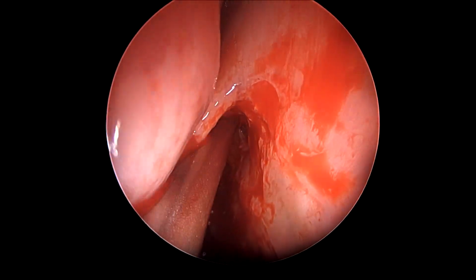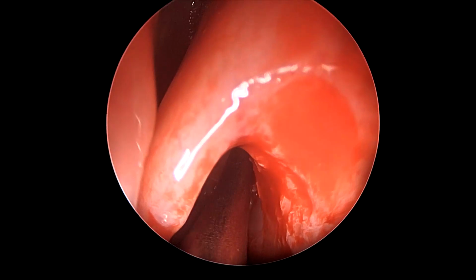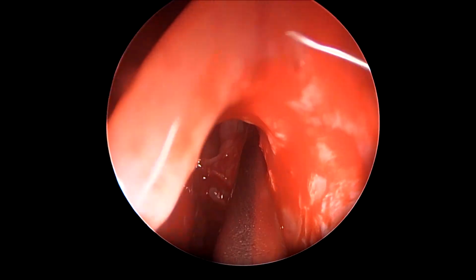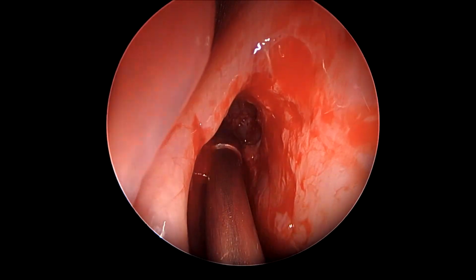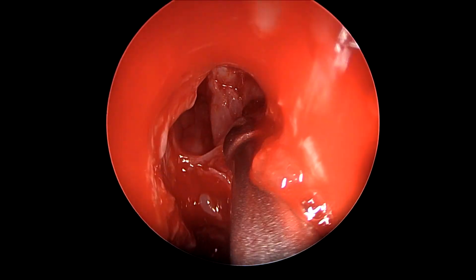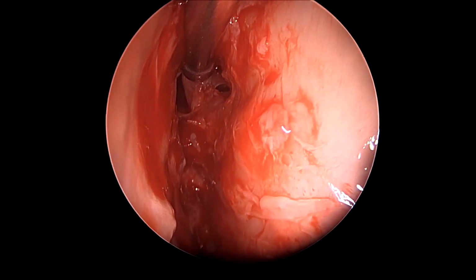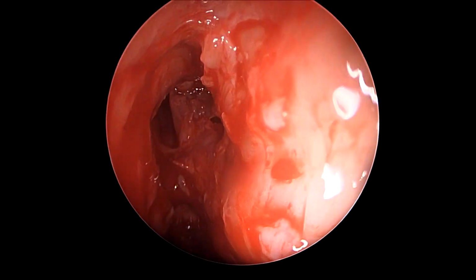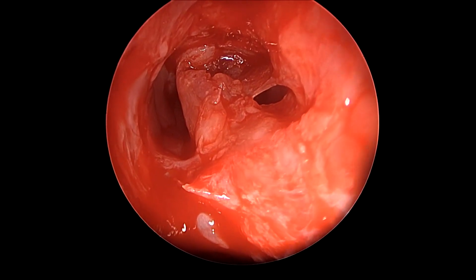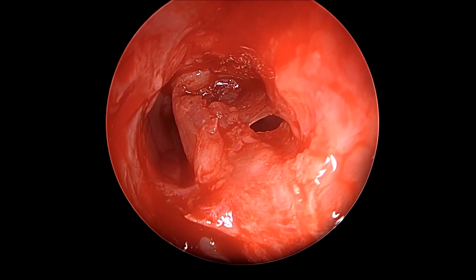So further removal of some bone from the beak, or frontal bone, or frontal beak area gives us a better view of this isolated frontal bulla cell that was blocking the frontal sinus. As we can see here, this is the wall of this cell, and one can hook around this cell and go inside the frontal sinus region as well. So as you can see, probably it's lying loose, but still it has to be removed to be able to get a clear view of the frontal sinus.